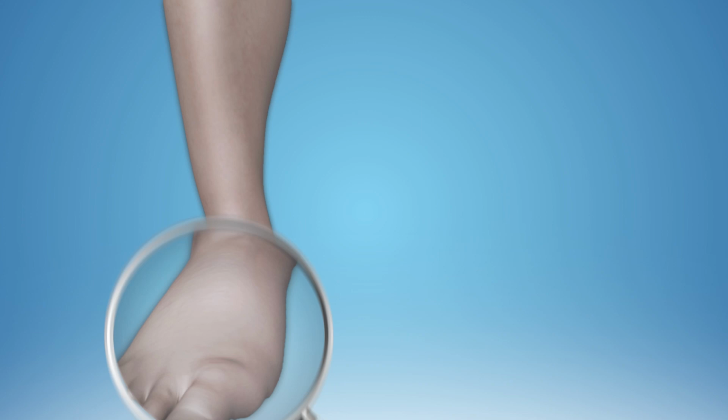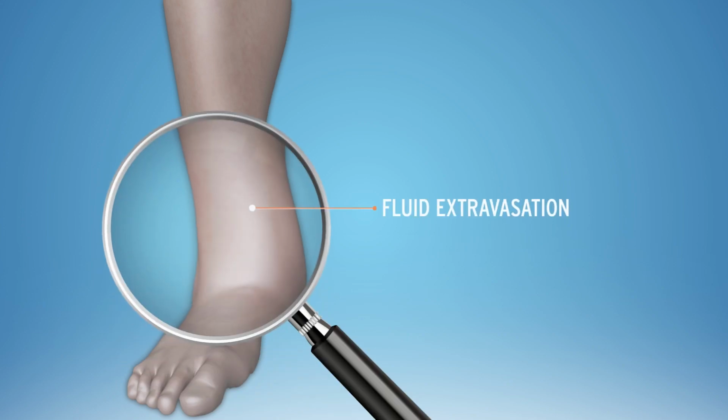Complications. The most common complication of the intraosseous needle insertion is fluid extravasation resulting from through and through penetration of the bone, or maybe from the incomplete insertion of the needle. In the case when an extravasation occurs, the needle should be removed and pressure has to be applied on the site.